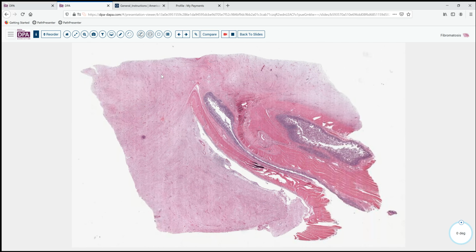So with that lesion present and an apparent appearance of resectability, in an effort to restore bowel function, she undergoes a resection of the mass. And a representative section is seen here. We can see that this mass is fairly pale pink in color, has a little bit of inflammation associated with it, and it appears to be somewhat extrinsic to the wall of the bowel.